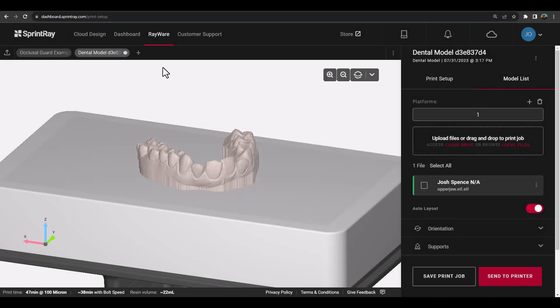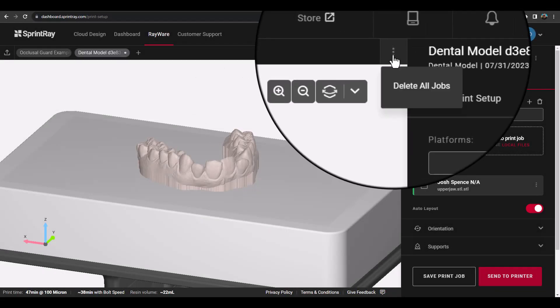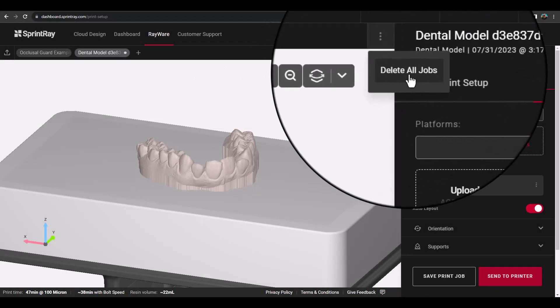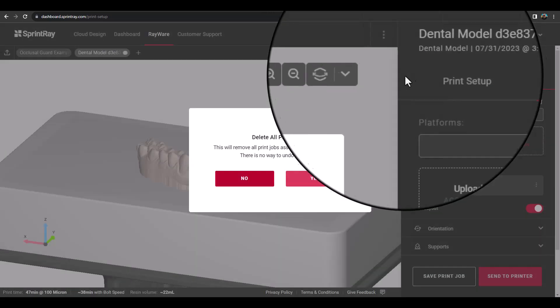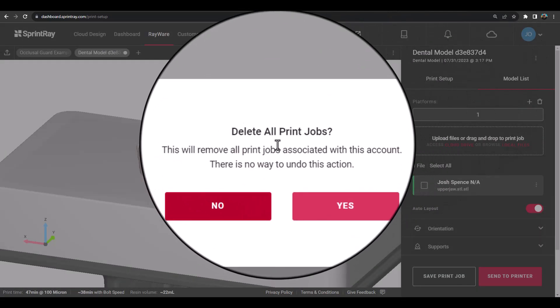At any time, you can delete multiple platforms using the delete all jobs option within the platform ribbon at top.